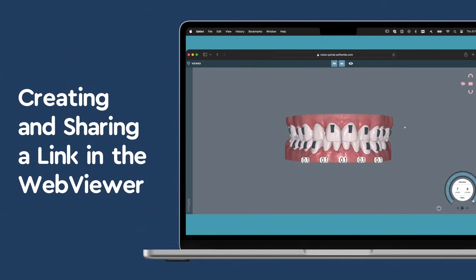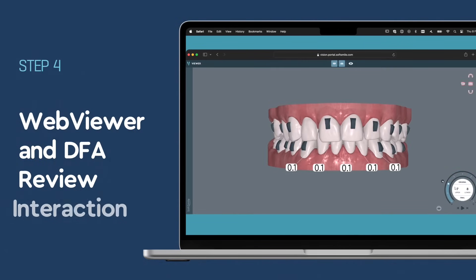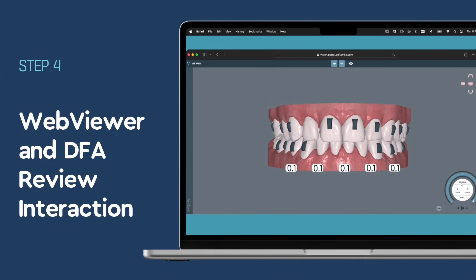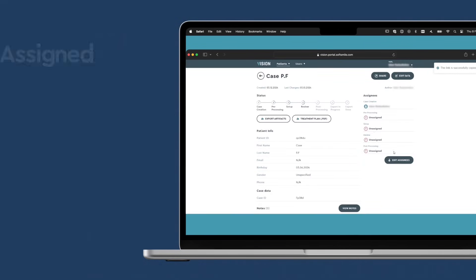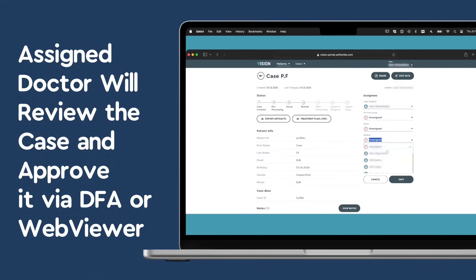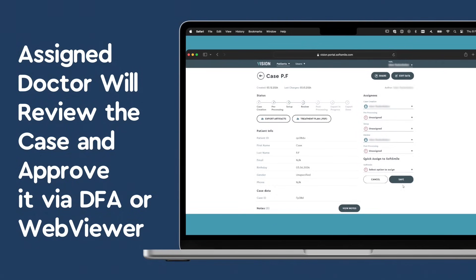After the design phase is completed, you will receive a link to access the WebViewer. This intuitive tool allows you to view the proposed treatment setup in detail.